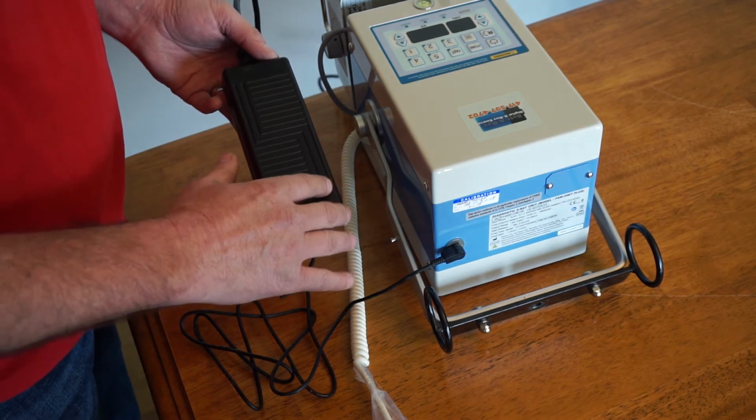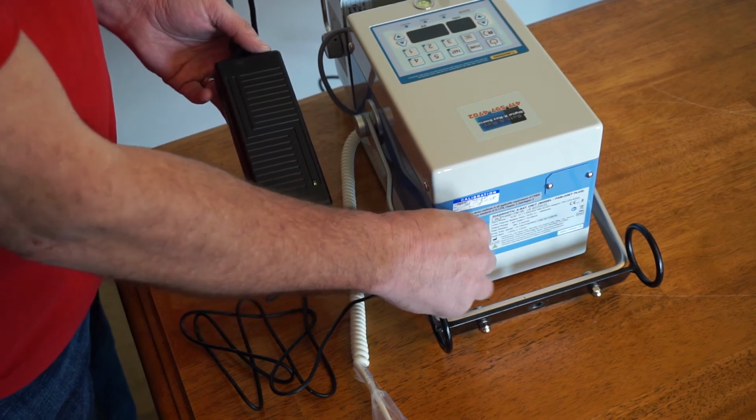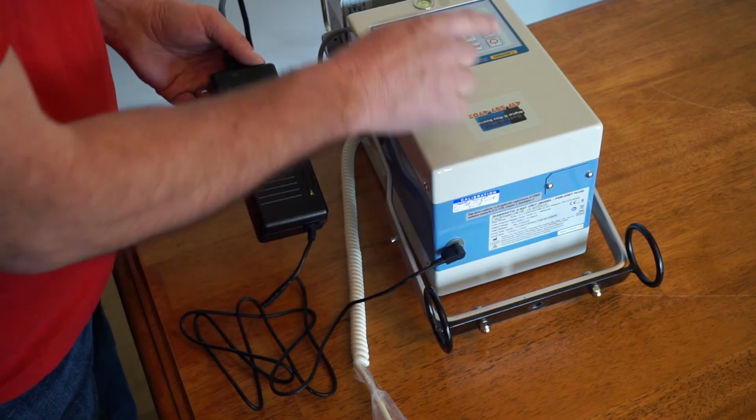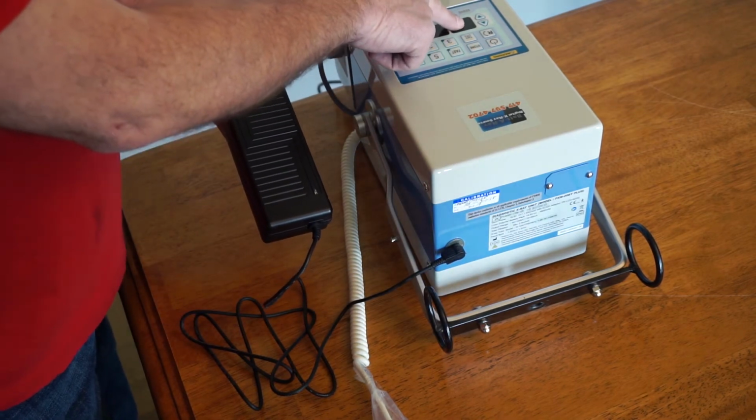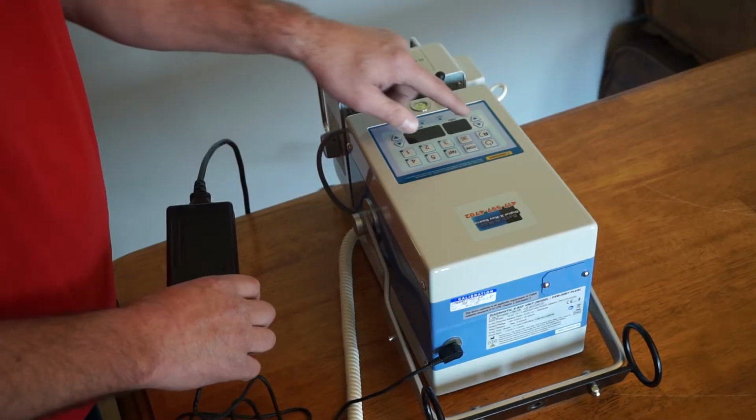It's really not. It turns into a trickle charge at that point, and it needs to remain on the charger till you can read 99 or 100% up here. It takes about an hour and a half for it to fully charge.